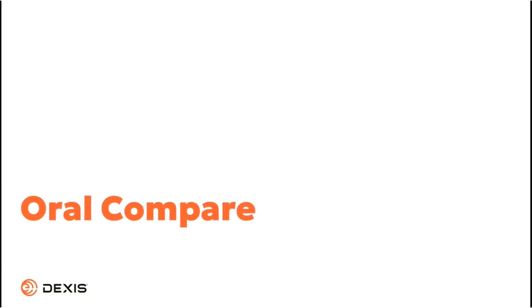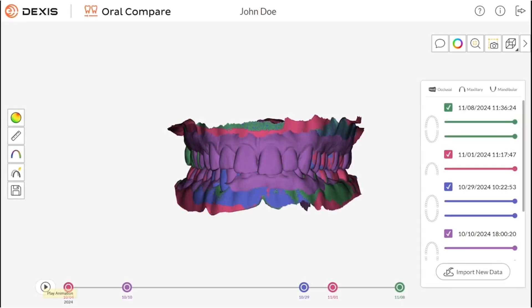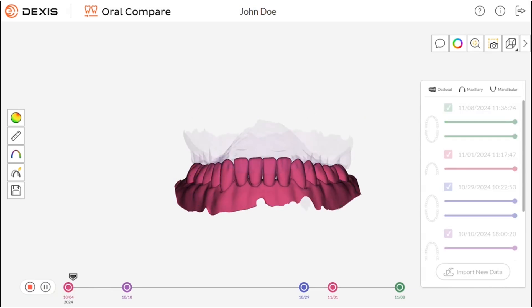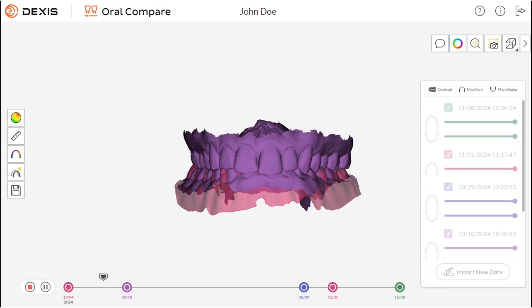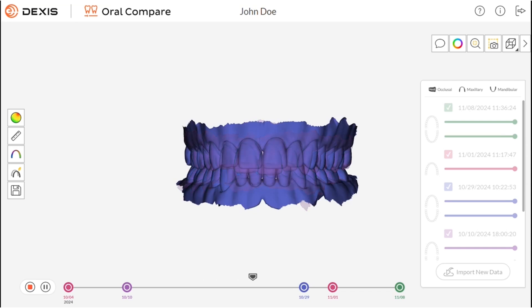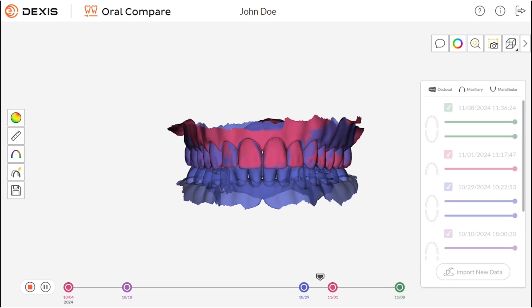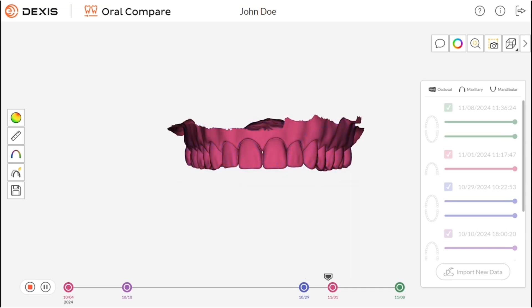Oral Compare. The innovative Oral Compare feature allows for automatic superimposition of multiple intraoral scans to visualize subtle changes over time, like erosion, wear, and gingival recession.